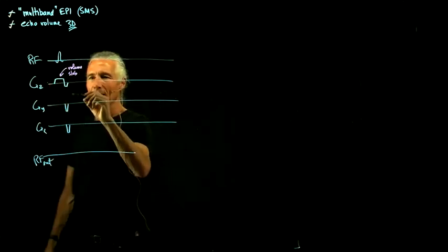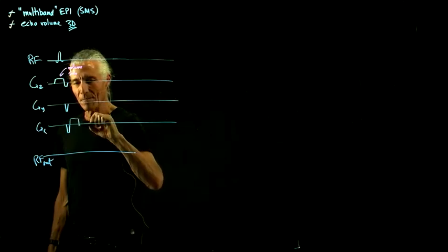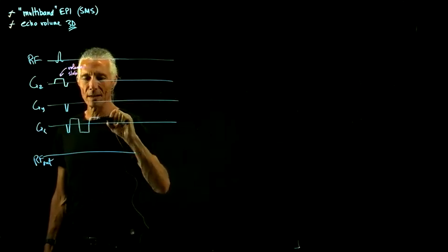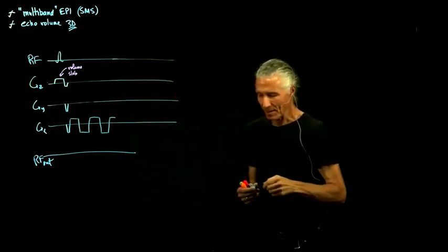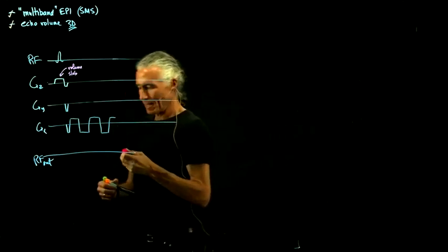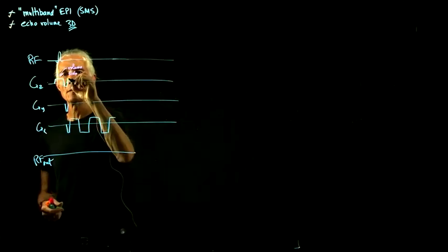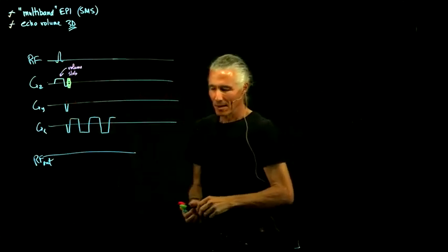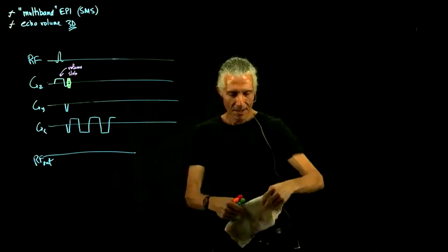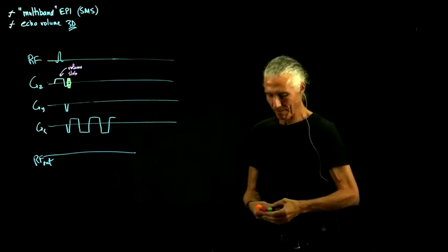And then just do our regular readout, where we just go back and forth across k-space. But the only difference is we do a bunch of phase encode steps over here. So that basically collects a cube of k-space instead of a slice.